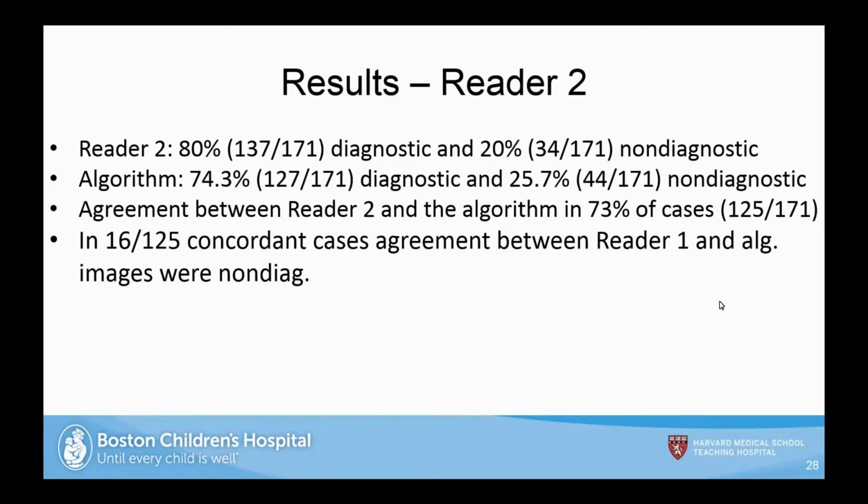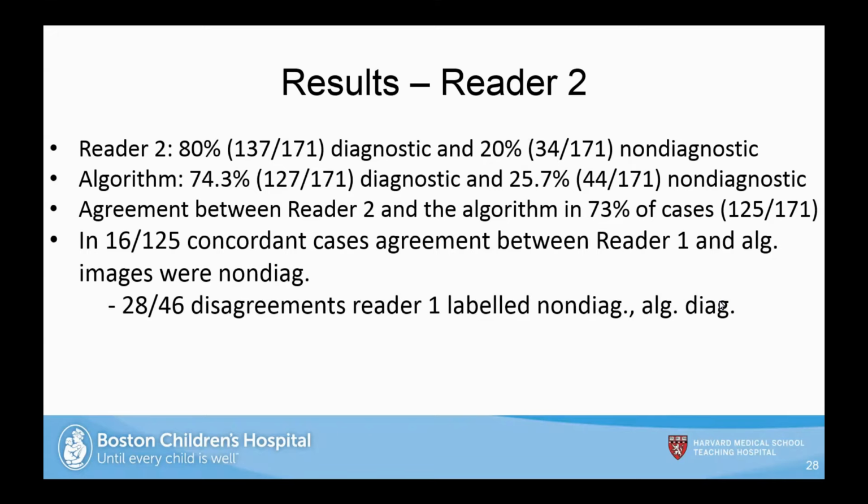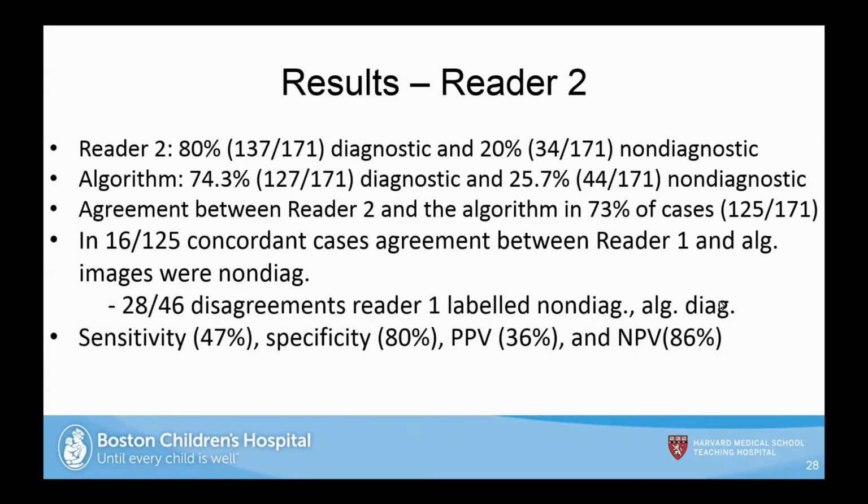And then 16 out of 125 concordant cases, there was agreement between reader 1 and the algorithm that the images were non-diagnostic. And then 28 out of 46 disagreements, reader 1 labeled non-diagnostic where the algorithm labeled it as diagnostic. And then they reported their sensitivity, specificity, PPV, and NPV.